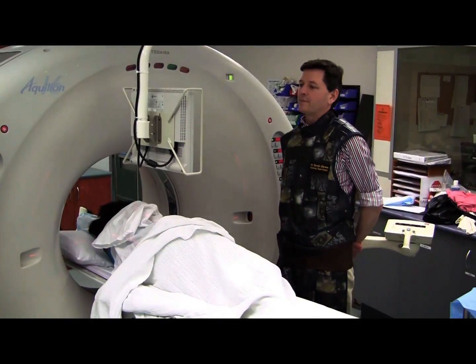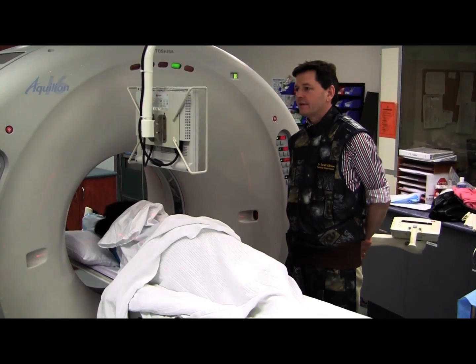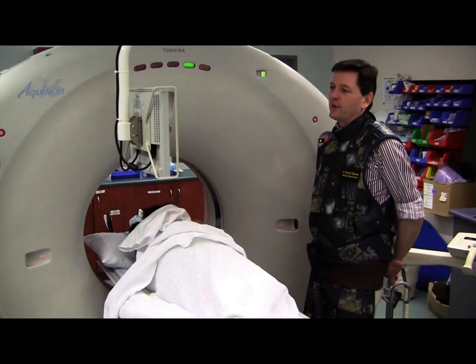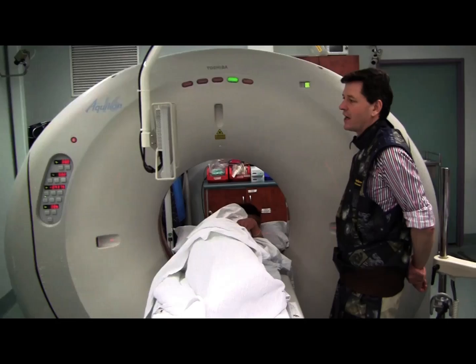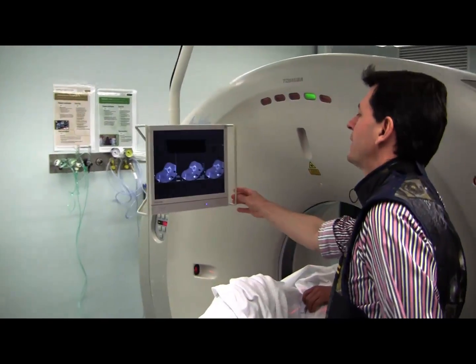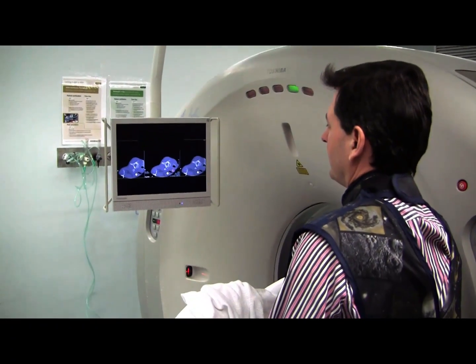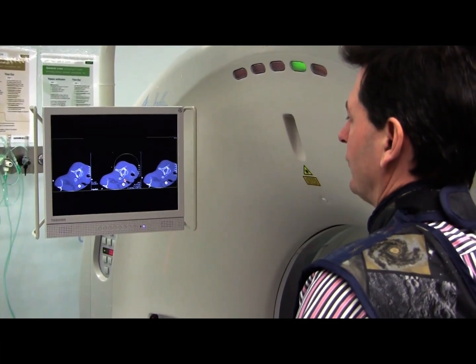We scan these at one millimetre slice thickness on 10mA so that we keep the dose low. There's very little noise in this situation anatomically. It's a small target, and there's high intrinsic contrast between bone and soft tissue, so we can run with very low dose rates. We keep the zoom in nice and tight, and we will be counting from below in this situation just to count up to make sure we're at the right level.